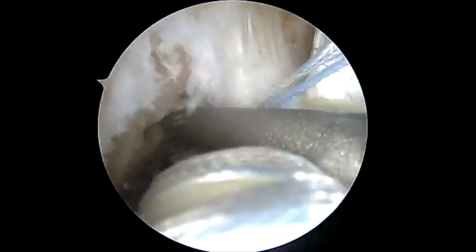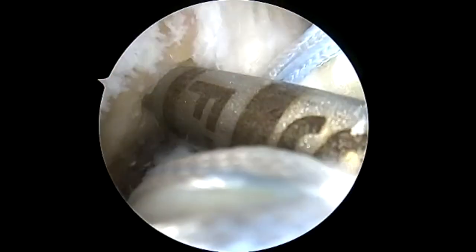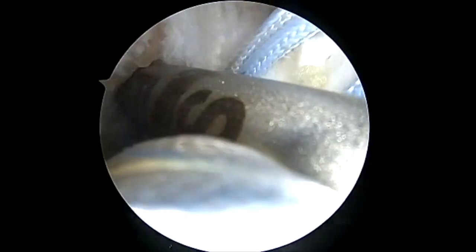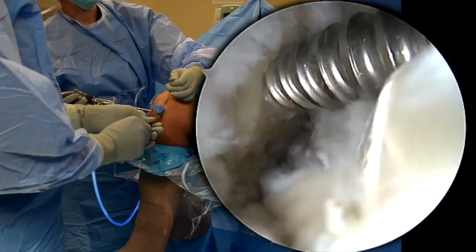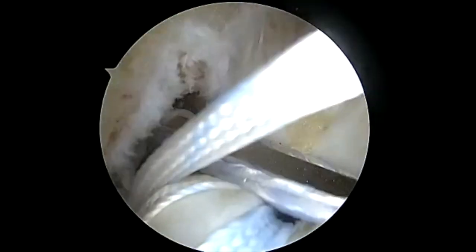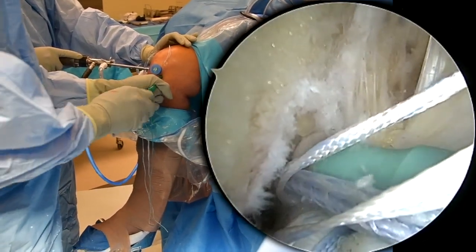With the knee at 90 degrees of flexion, a 4.5 by 20 mm hole is punched and tapped into the origin of the anteromedial bundle within the femoral footprint. The suture threads are loaded to a 4.75 mm vented biocomposite SwiveLock suture anchor that is preloaded with FiberTape and placed into the already prepared footprint.